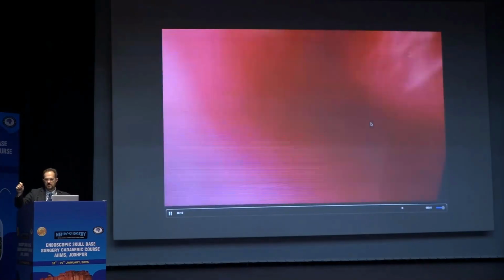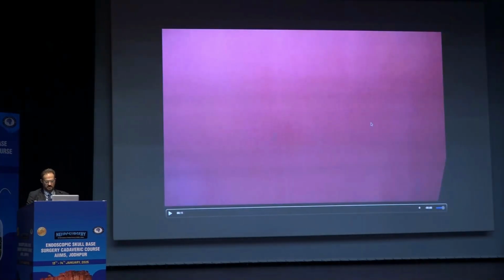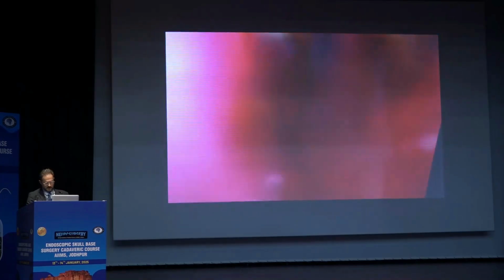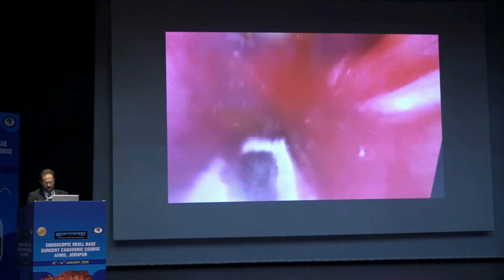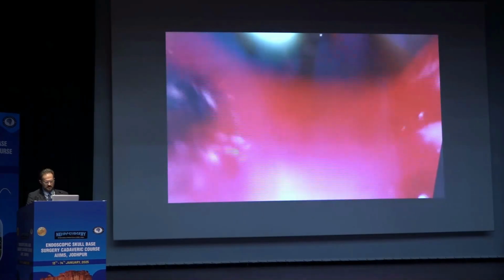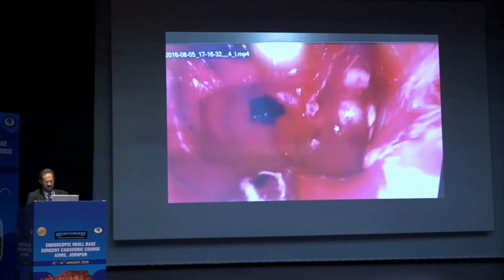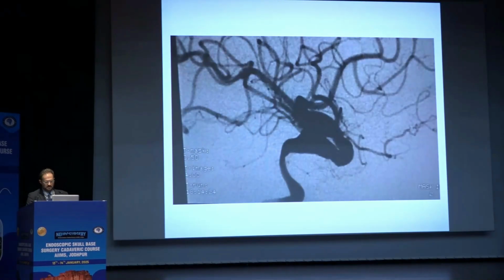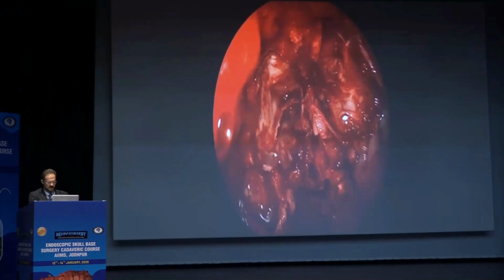Once they entered the sella, it was just taking the clots of an aneurysm, so then he had to repack, and the patient apparently did fine, but you don't want to be in that situation. So just pay attention: if dark T2, you may actually be dealing with an aneurysm. This is post-op, and they did fine.